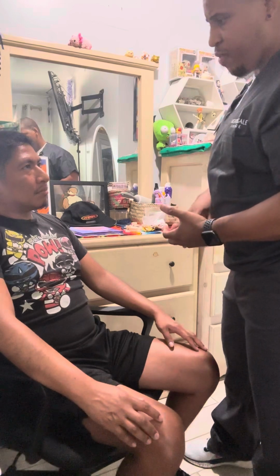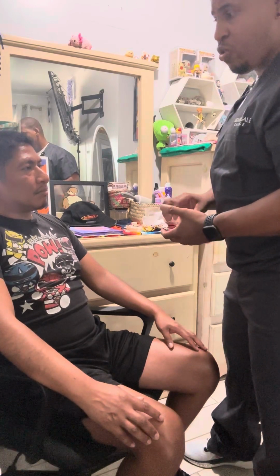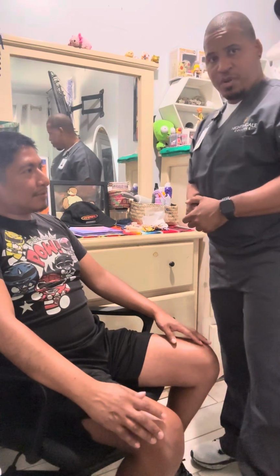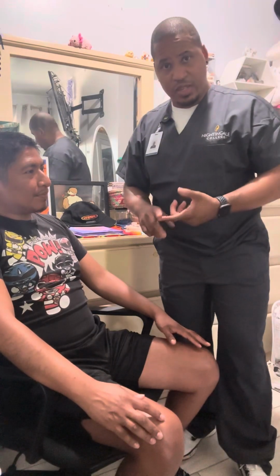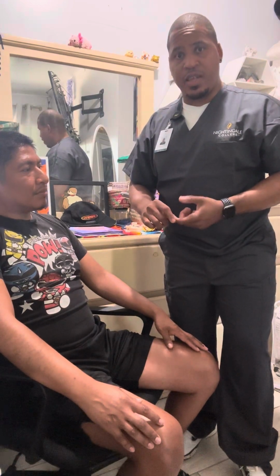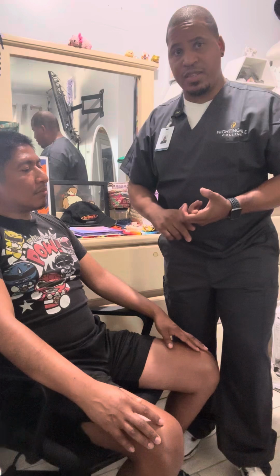I'm here to take your vital signs. I'll be doing your pulse, respiration, and blood pressure. Are you okay with that? Yes. Perfect. So, first thing I'm going to do is check his pulse. And I'm going to give you the stats for the pulse.